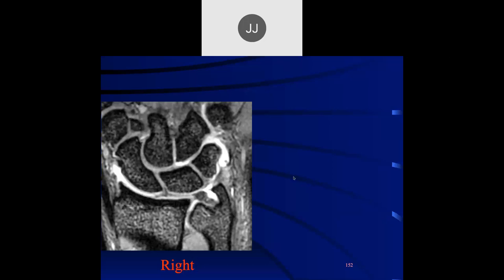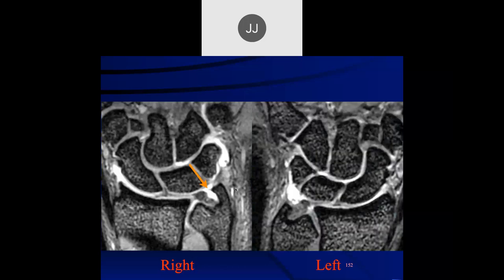Here it looks like the styloid attachment — the lower laminar attachment — looks like it's torn. If you go to the other side, we can see it looks like a much more robust attachment on that side. So that's a lower laminar tear.